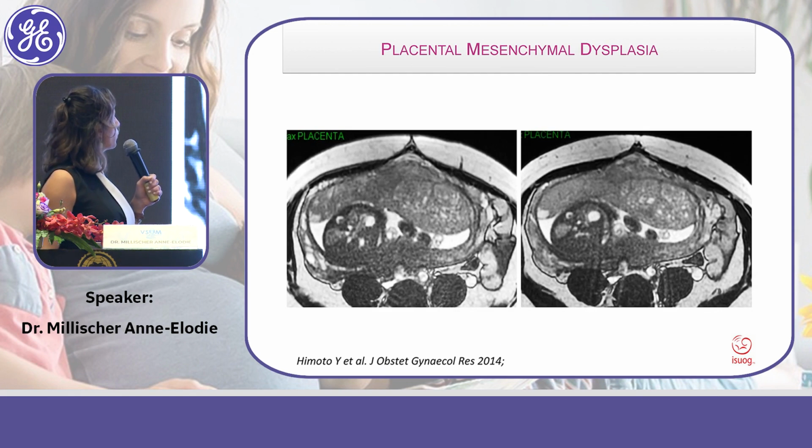Here an example with MRI of a mesenchymal dysplasia. You can see that it could be just a part of the placenta.